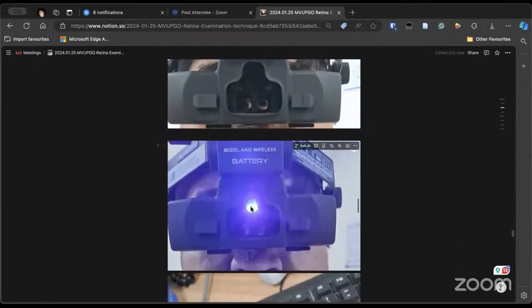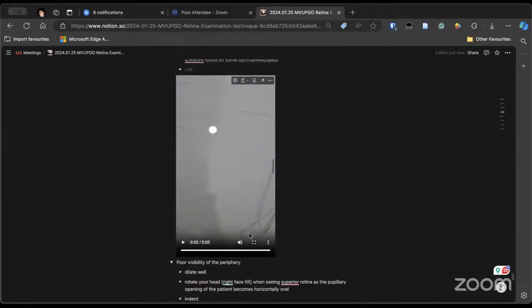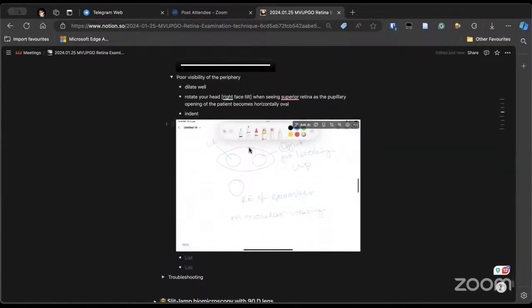These are the three things. This light, and there are two pupils. Can you see that? Yes. So when you rotate your head, this is what happens. The patient is looking up, so the pupil which is visible to you now appears oval. Through this oval area, both your right and left eye and the light cannot pass through. You will have to use the small pupil setting, and it is difficult.